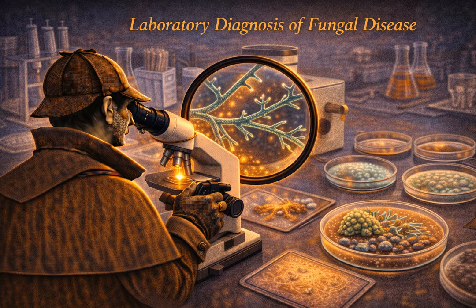Okay, let's say we have growth. We have a colony on the plate. Now we need section 4, identification, naming the suspect. Identification always starts with gross morphology. What does the colony look like to the naked eye when you hold the plate up to the light? Yeasts versus molds. Yeasts generally look a lot like bacterial colonies. Pasty, opaque, creamy, smooth. They often smell distinctive, too. Candida smells like baking bread or brewer's yeast. Cryptococcus can look very mucoid or shiny and slimy because of its massive polysaccharide capsule.